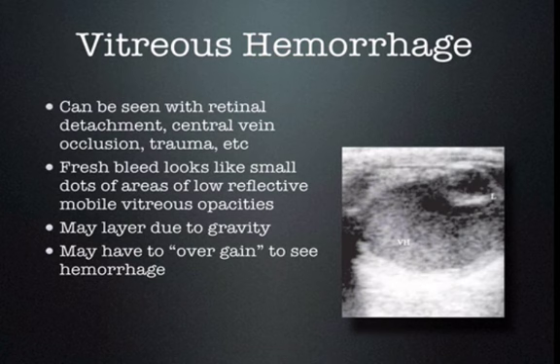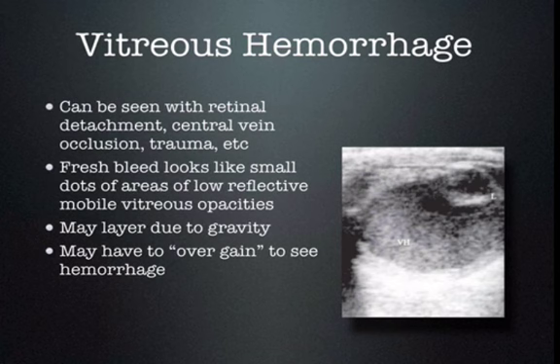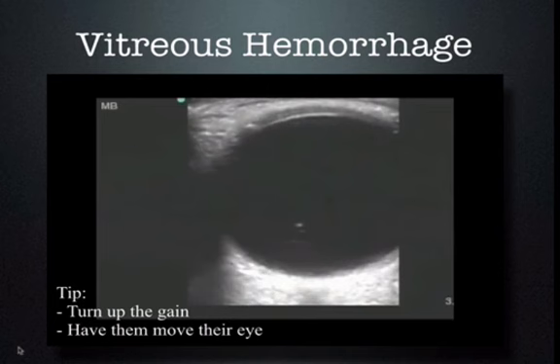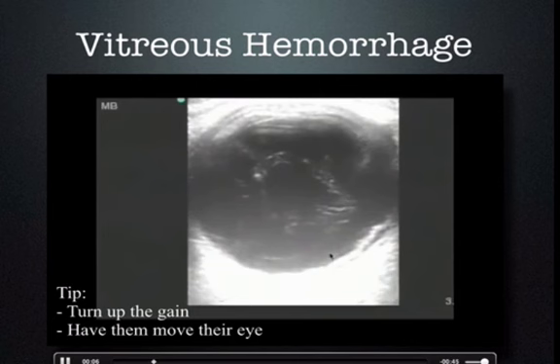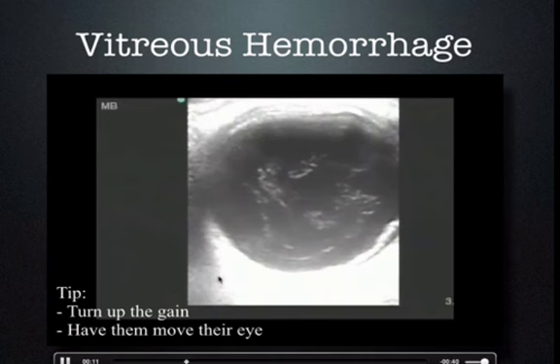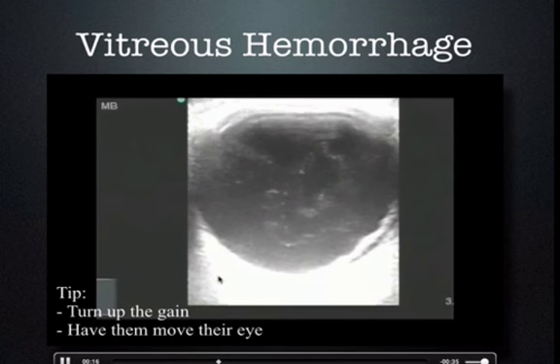Vitreous hemorrhage is also easy to see and can occur with many conditions such as retinal detachment, central retinal vein occlusion, trauma, etc. Fresh blood looks like small dots of low reflectivity and they're generally mobile. If you have the patient move their eyes from side to side, you'll get swirling of the blood in the vitreous — this is the 'washing machine sign.' It may also layer due to gravity. You may need to turn the gain up to really see it. Here we have a picture where, as we turn up the gain and have the patient move their eye, we see blood swirling — a vitreous hemorrhage due to a retinal detachment.